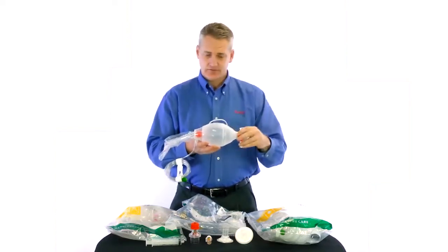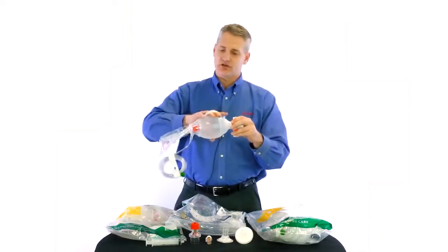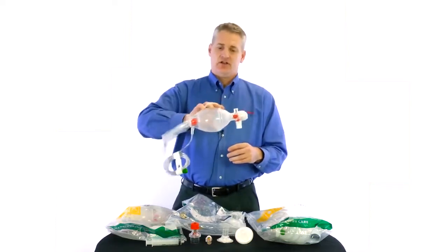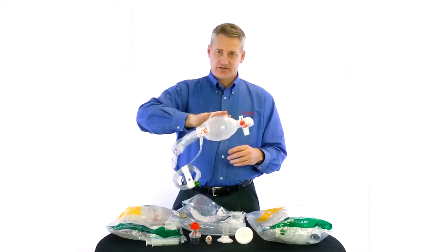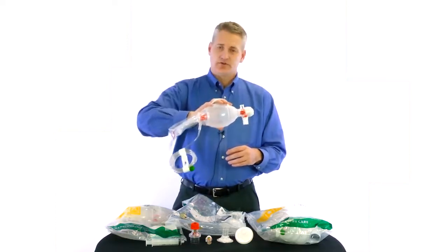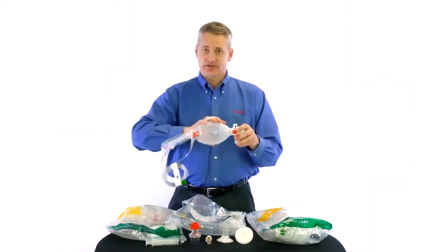We also have our integrated handle, just like on the adults, where you can put a couple of fingers in there and give very consistent ventilations. You can also relax your hand and hold the bag with your shoulder or forearm and upper arm. It also reduces hand fatigue and prevents blistering.